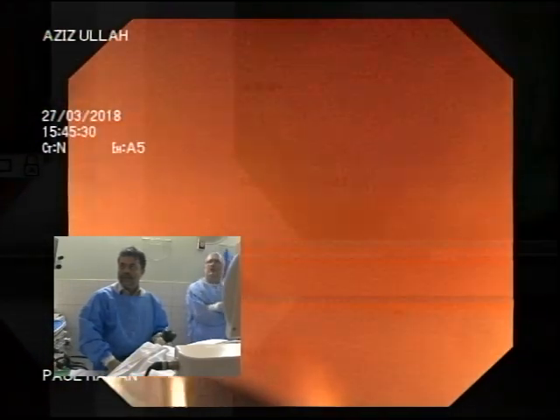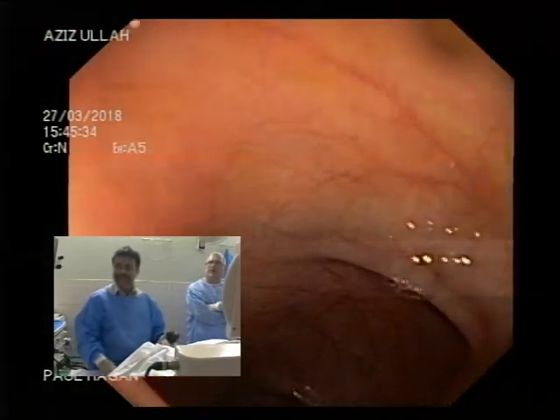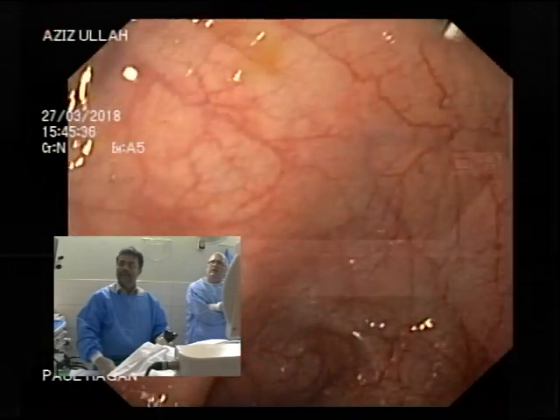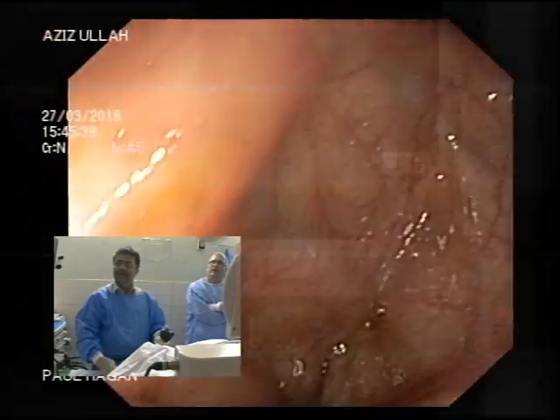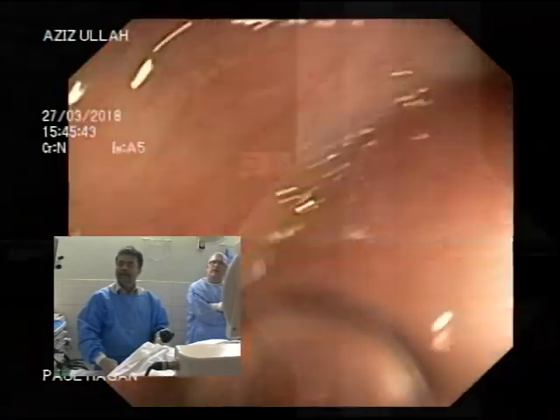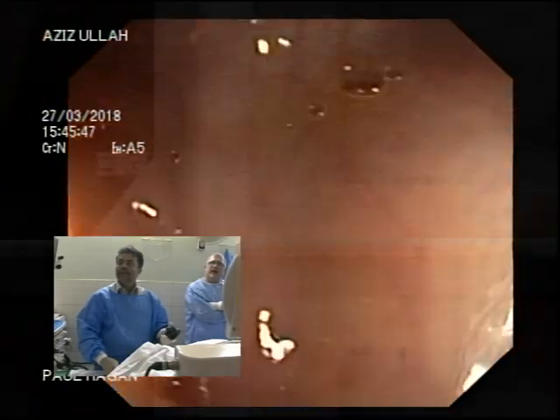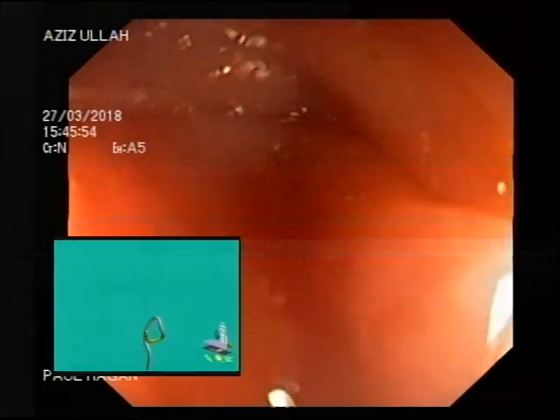Where's the lumen? Gone, gone. Keep going. Keep going. Go on. Advance. Advance. Advance. Now, drop the scope down.